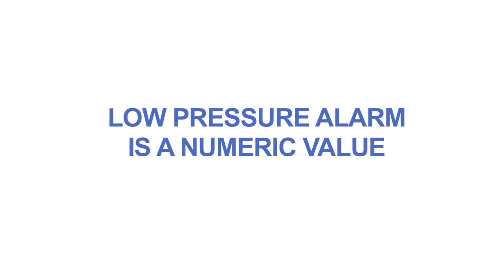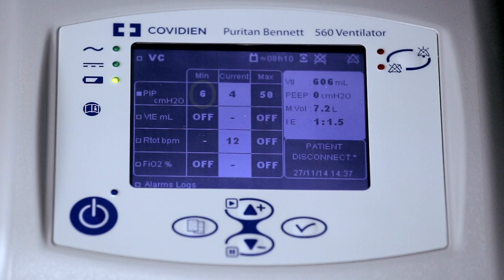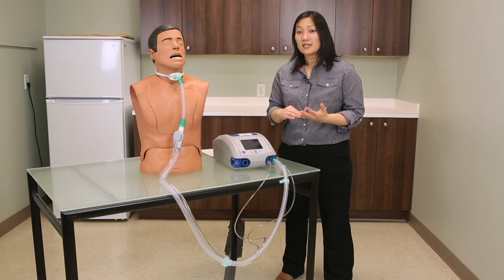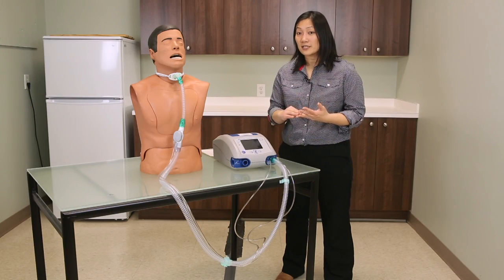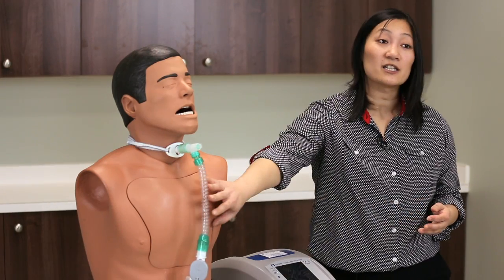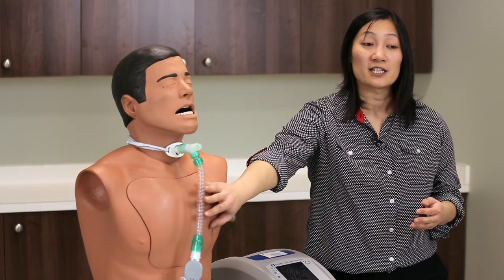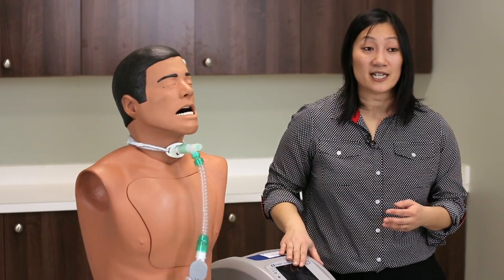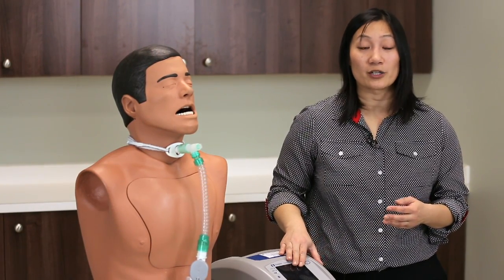The low pressure alarm value is a numeric value found on the alarms menu on the ventilator. The ventilator will alarm visibly and audibly when the pressure measured distally in the circuit is lower than the actual value set on the low pressure alarm.